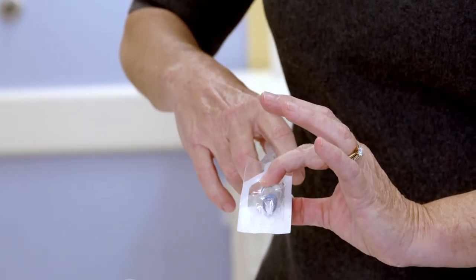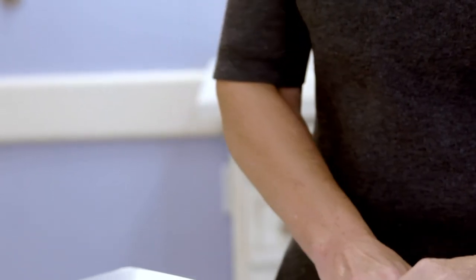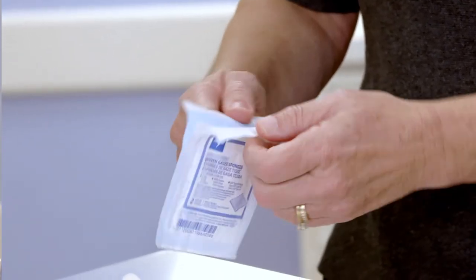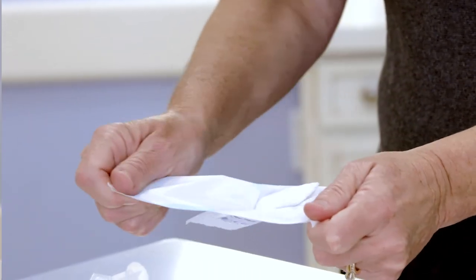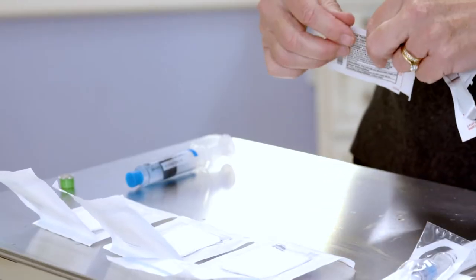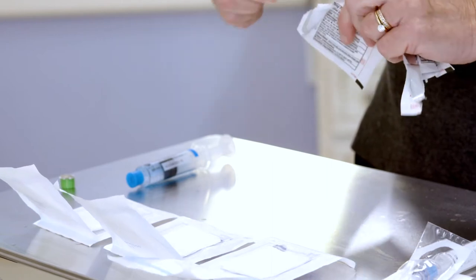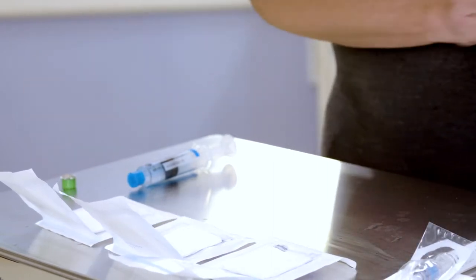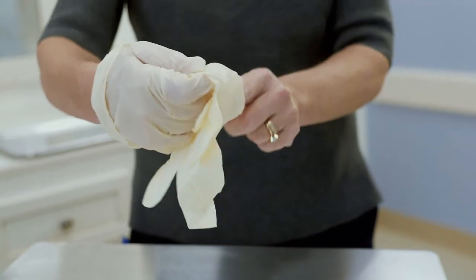Flush with normal saline. Open the gauze and alcohol packets. Leave the gauze pad on top of the packet. Put the alcohol pad on top of the gauze pad. Only touch one corner of the alcohol pad. Next, put on clean gloves.